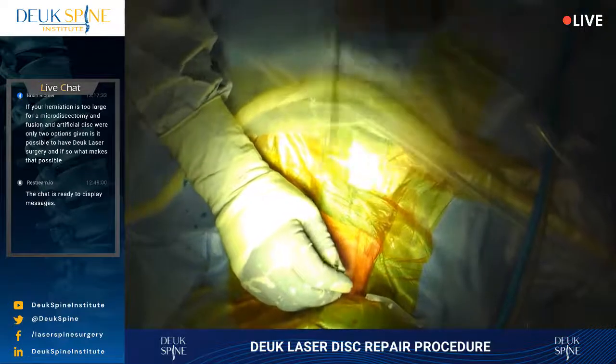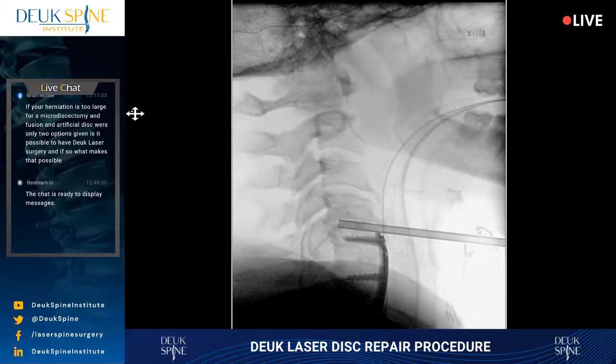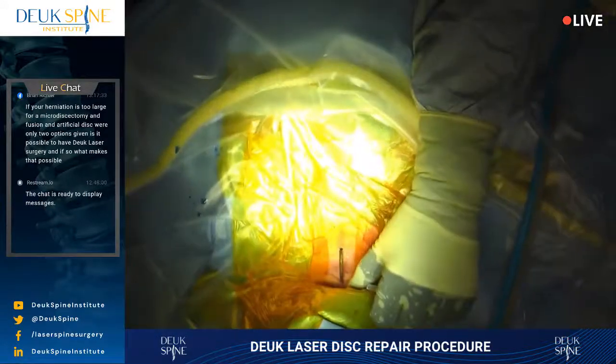So we'll take the dilator out, and now take a look, folks. I know we've had some people interested in endoscopic surgery in the neck for herniated disc in the cervical spine, but this is it. Okay, you can't see her jaw, but her jaw is up here, her face is here, she's intubated, she's asleep. Thank God she's asleep, because she wouldn't tolerate this very well if she was awake.